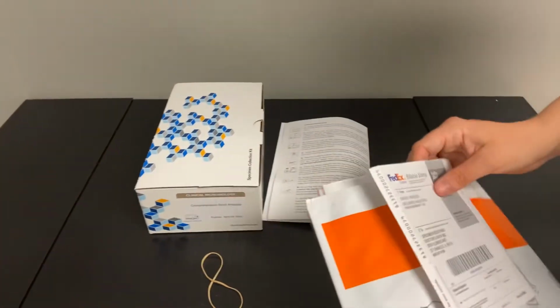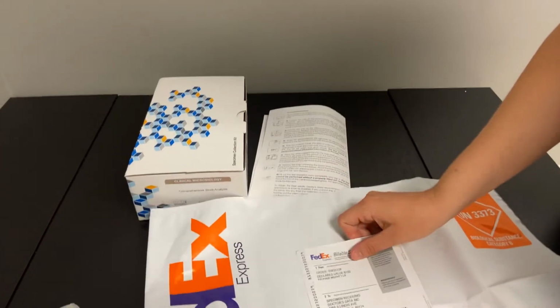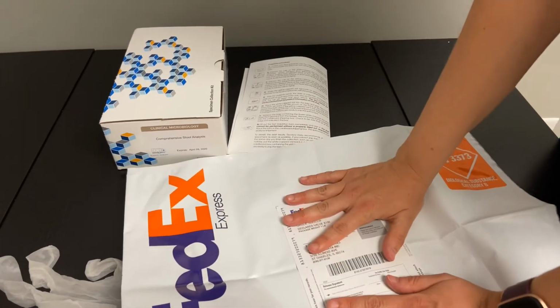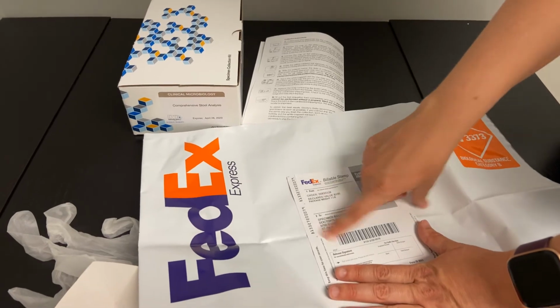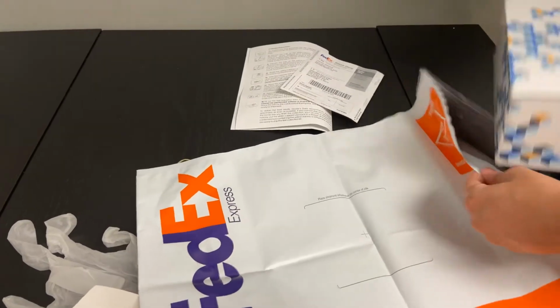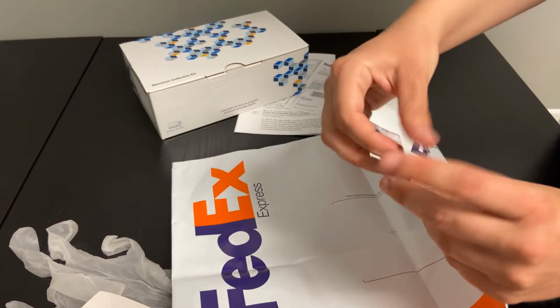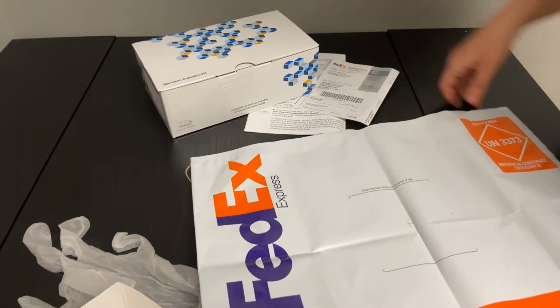Obviously the gloves and the remaining stool that you have from the day prior can be tossed out. You'll have this FedEx bag here with the prepaid billable stamp. You can take the adhesive back portion off, stick it onto the bag. You're welcome to put your return address if you'd like in the front box. The 2 section is where that is going. You'll take this box and slip it into this bag just like that. You'll close it and get all that air out of there, and then take off this piece of red tape type substance, and then you'll close it to make sure that it's nice and stuck.